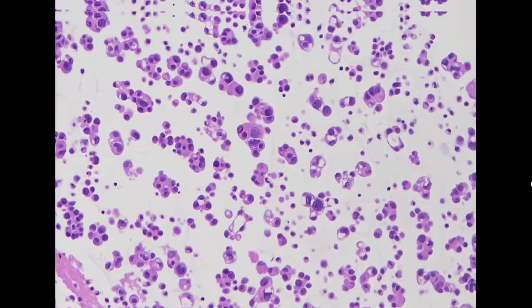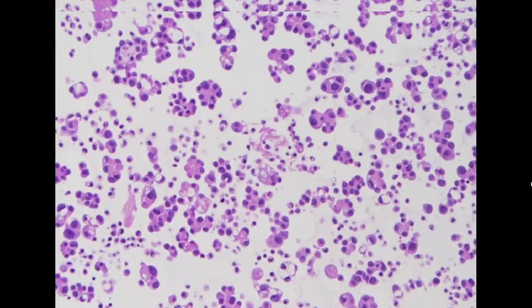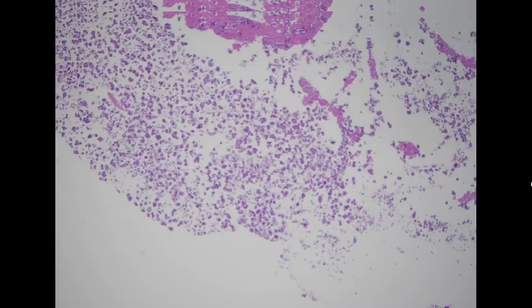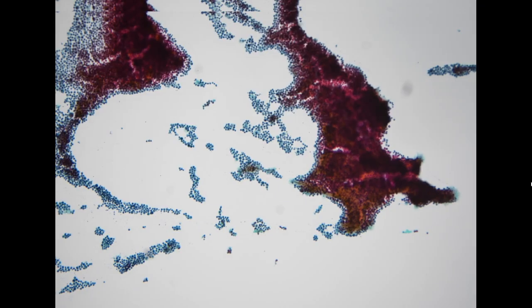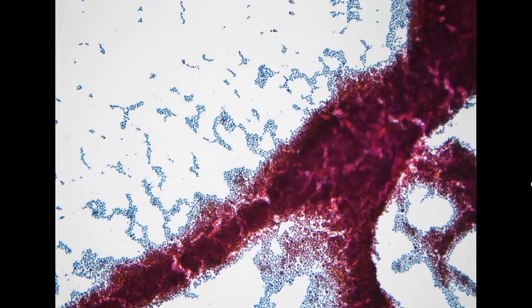Even though the cytospin preparation was not very successful, next time try to smear it into more of a monolayer smear. But our cell block preparation is very successful, so we see a lot of tumor cells here. So this is positive for adenocarcinoma, and we can use the cell block preparation for molecular testing. We will first do EGFR testing because the positive rate is around 50%. If the EGFR turns out negative, we will proceed to NGS testing.